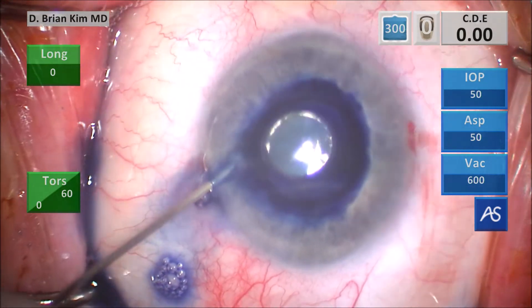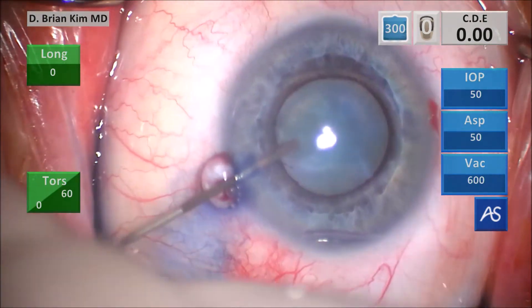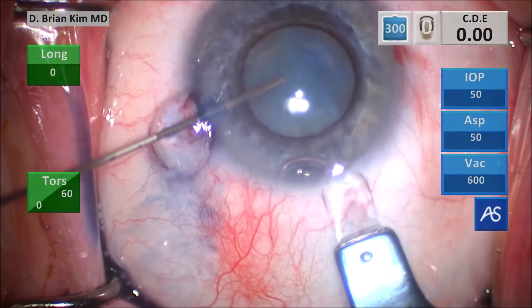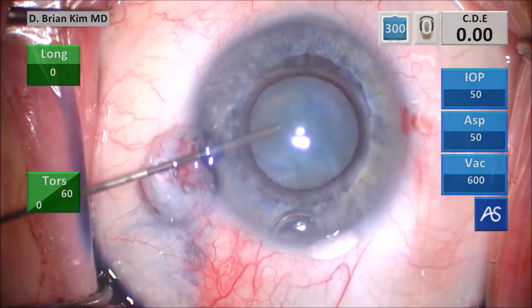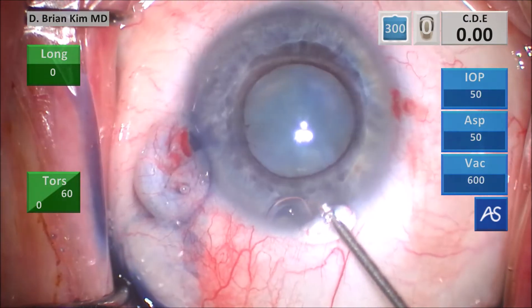This is some dispersive viscoelastic to push the dye and the bubble out. You can see there's nice visco-dilation of the pupil as well. This is a triplanar corneal incision — I make a vertical groove, place the blade into the deep part of the groove tunnel, and then I enter. And these are the Moria micro-rhexis forceps.